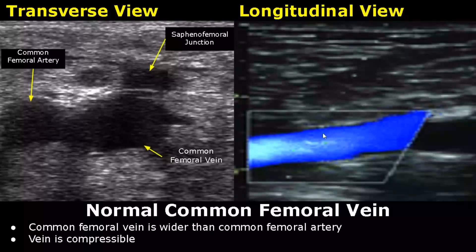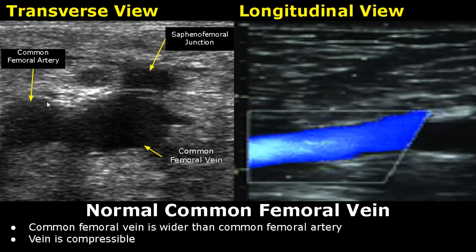We have transverse and longitudinal images of the common femoral vein. Here it is seen alongside the common femoral artery and the saphenofemoral junction in cross-section. The common femoral vein is wider than the artery and it will be compressible when we apply pressure with the probe.